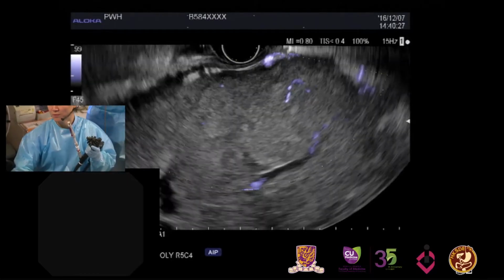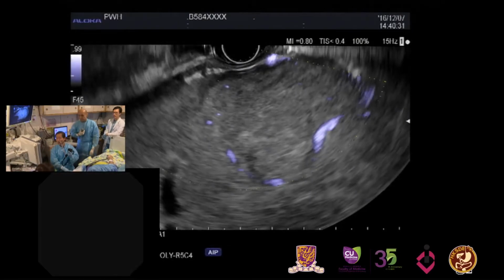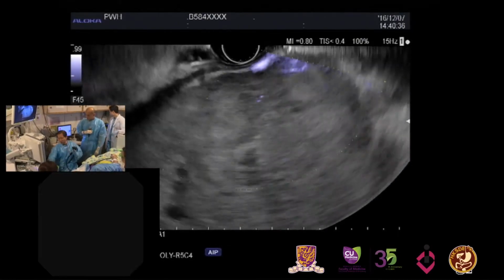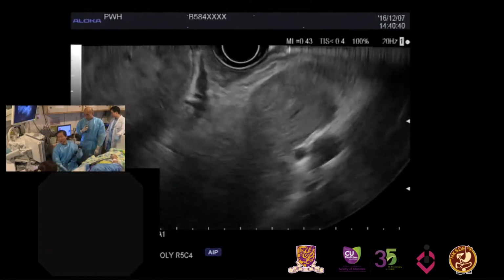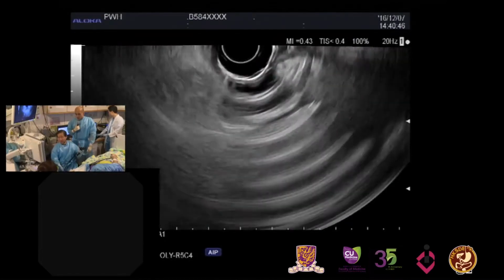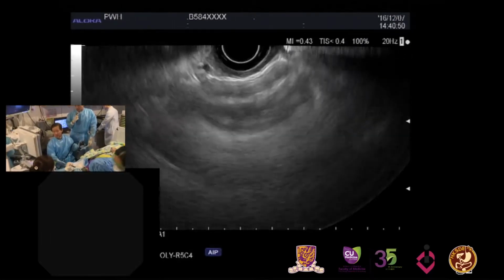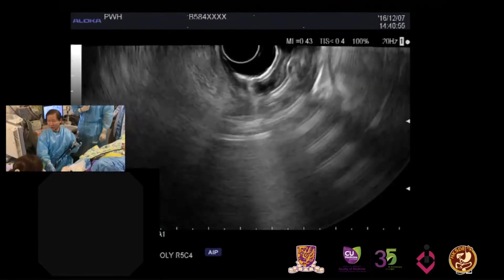Would you want to puncture in an area where the lesion is connected to the stomach? I think this one is okay. Do you want to target the intragastric area? Yeah, in terms of surgical principle, we usually try to resect where it's connected to the stomach. So maybe that's better to avoid tumor seeding in the future. Yes. Okay, I will follow your instruction.